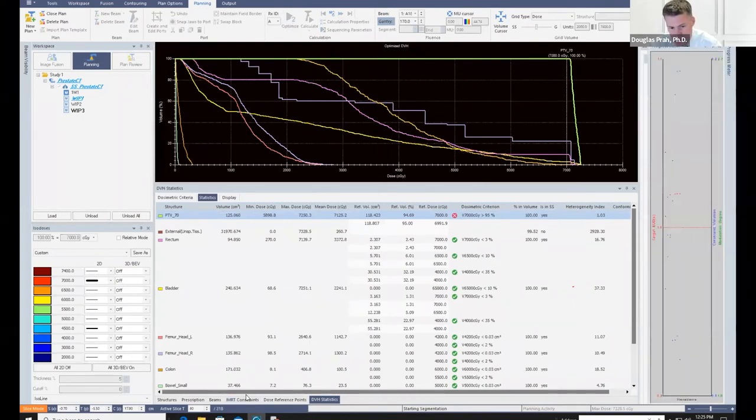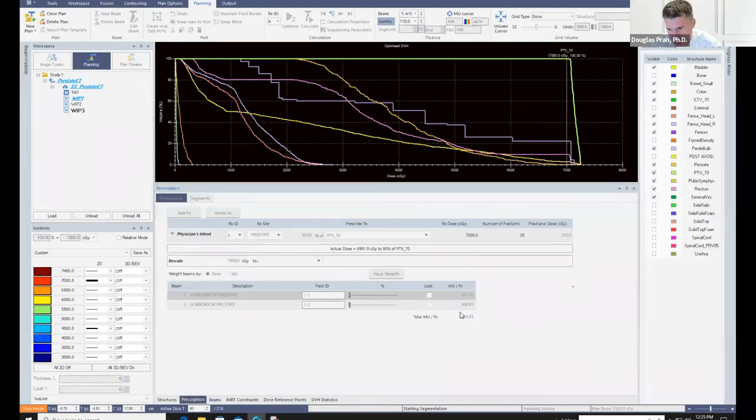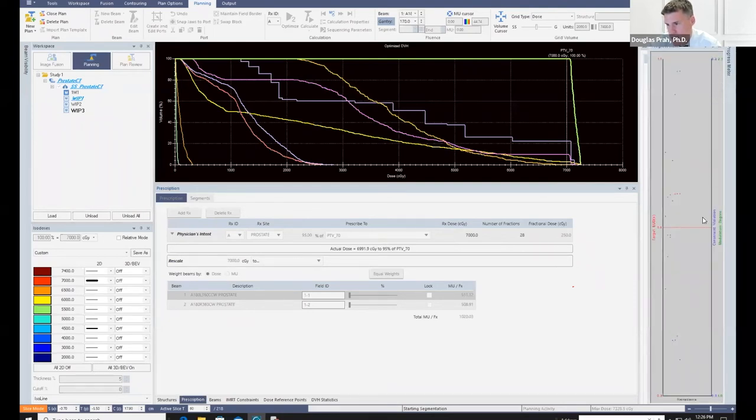So if you look at the monitor units, it's basically the more modulation there is, the, I call it the IMRT factor. You use it in shielding calculations, but it's the ratio of the total monitor units to the fractional dose. So you can see right now we're at about a four. So four times more monitor units than dose. And the more modulated it gets, you're going to see that this number will increase. So the more complicated the plan is, usually this number will go up. And there is no upper limit. It doesn't cap it at any value.